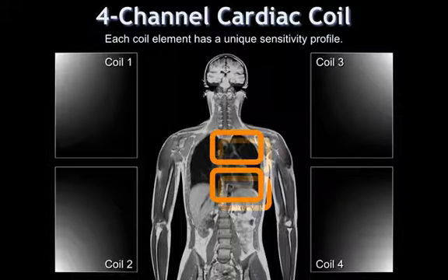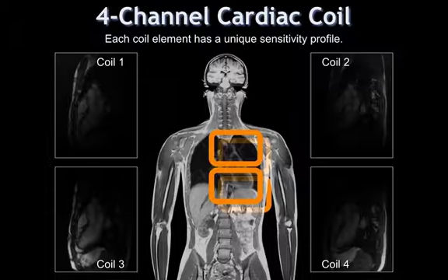And so most of our MR systems use several coils and combine information. We'll talk about this at the very end of the lecture, but combine information from many coils, what we call channels. This is a four-channel array. We can combine images from all those to get a sort of more uniform image over a pretty large field of view. And so this is what the images from those individual locations might look like.